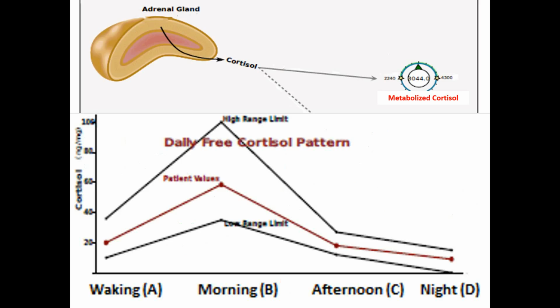As we're looking at the cortisol, there's a lot of different data that we can look at. Probably the most important bit of that is the pattern of cortisol over time, and then the total production of cortisol. Those are probably the two most important things. So we've got 4 different collections. The waking collection is a waking urine sample, but it's not a reflection of waking cortisol, right? It's a reflection of the cortisol during the nighttime, so essentially a while-you-were-sleeping cortisol.